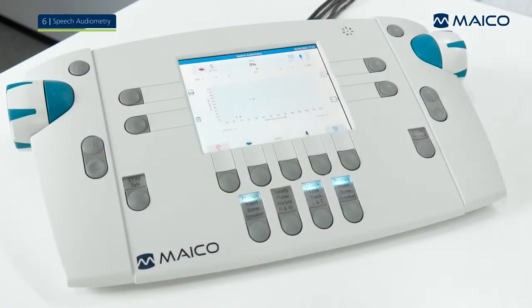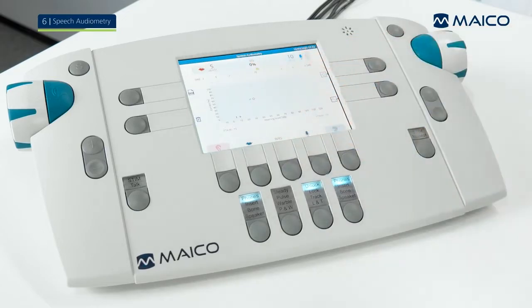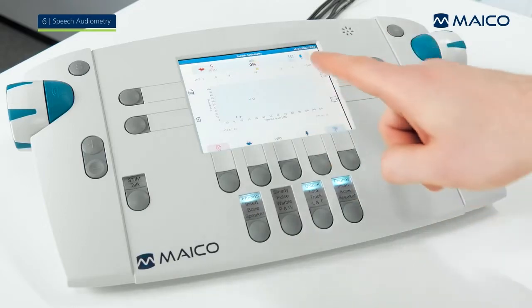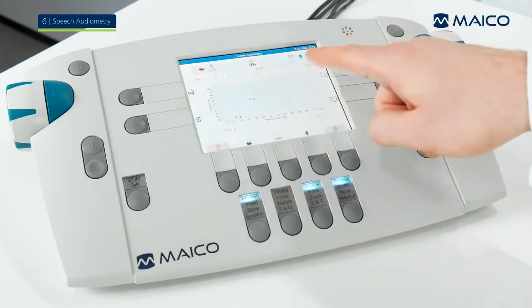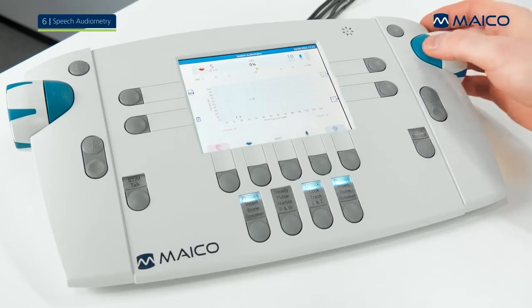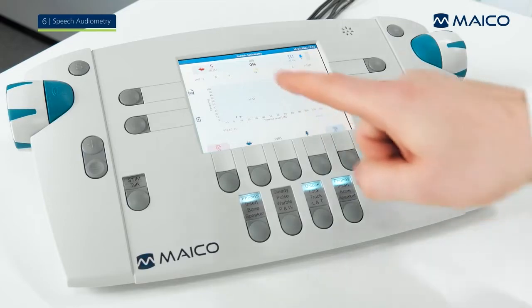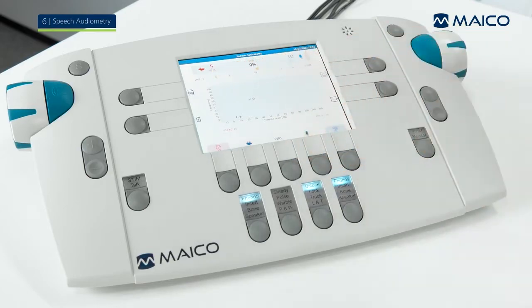The speech audiometry test screen is divided into different sections. The numerical bar gives a quick overview of the test parameters of the 2 channels. It includes a counter for WRS testing and shows the selected level, input signal and stimulus indicator. The indicator lights up when the input signal is presented to the patient. Below the numerical bar, the VU meter is displayed. The VU meter allows you to monitor whether the levels of the input signal are correct.